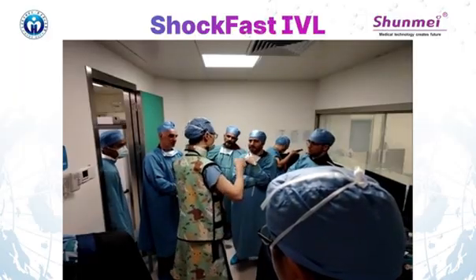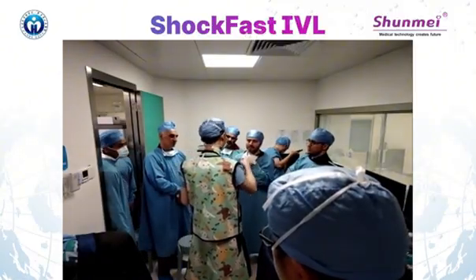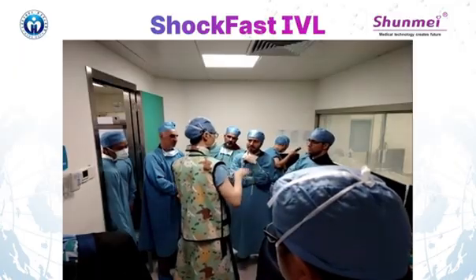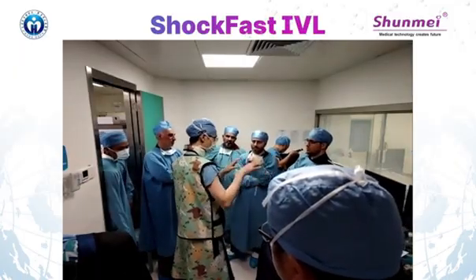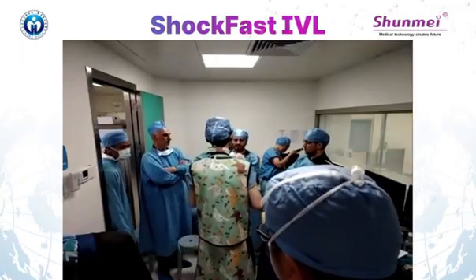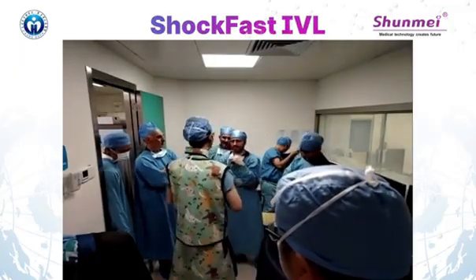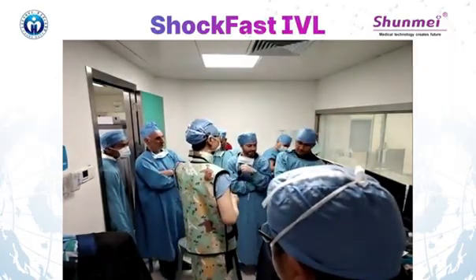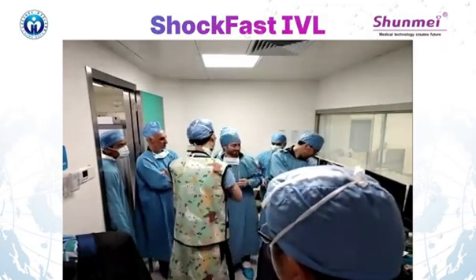When the deep-seated extension catheter is so distal, the blood pressure goes down. Pressure damping, yes. So there's no time for me to leave it there for long. Thank you very much.